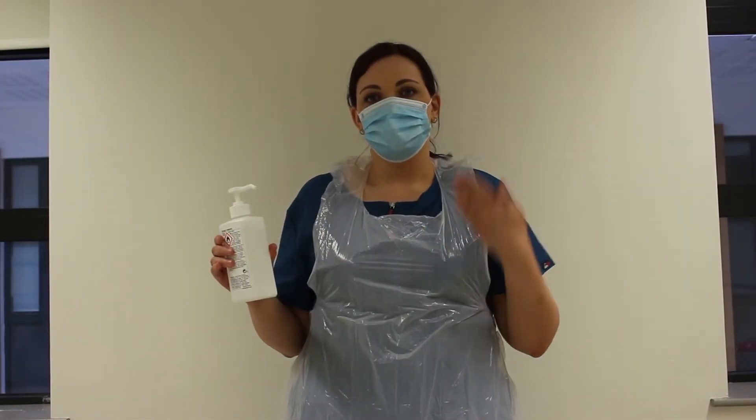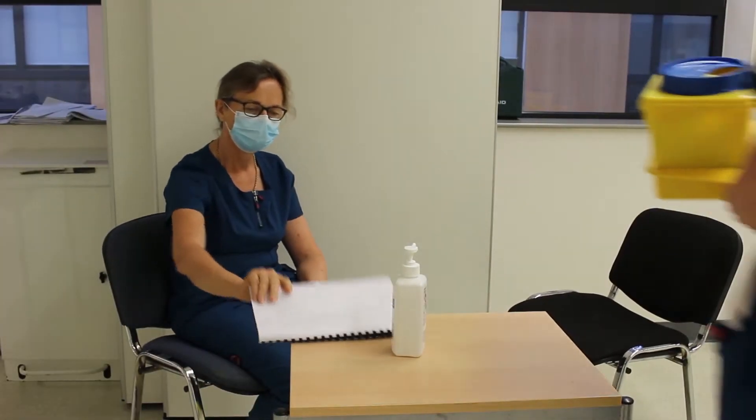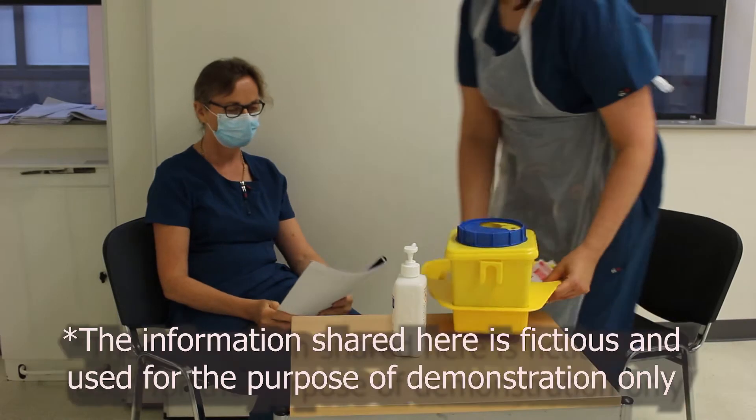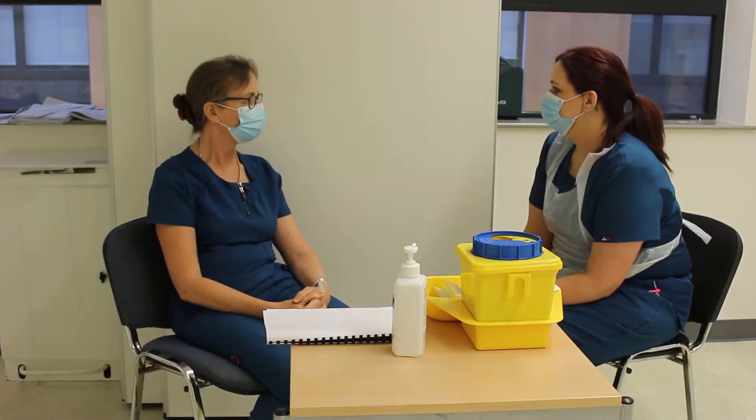On entering the patient zone, I'm going to clean my hands again and put on the appropriate PPE. Hi there, how are you? Hello, I'm good. My name is Siobhan, I'm the nurse in the section today.